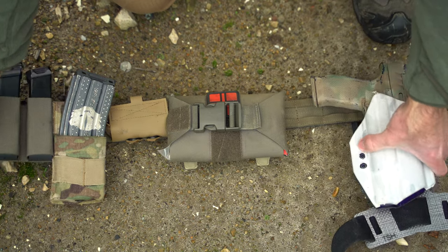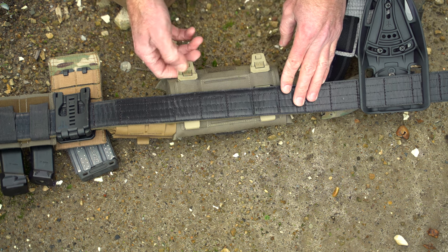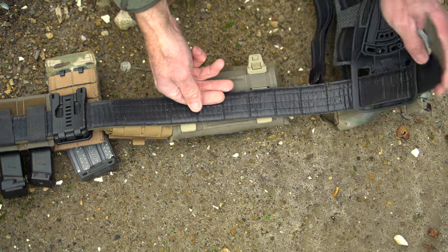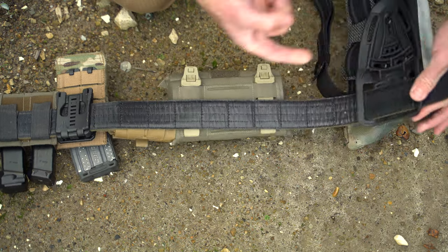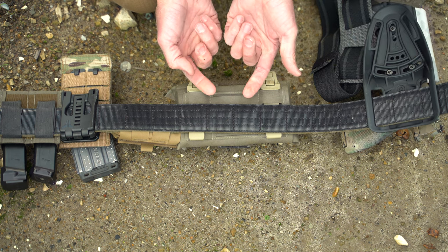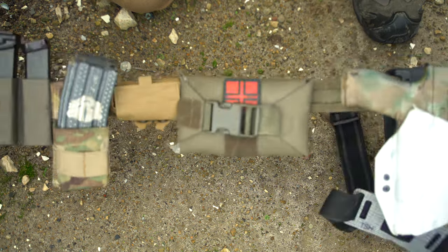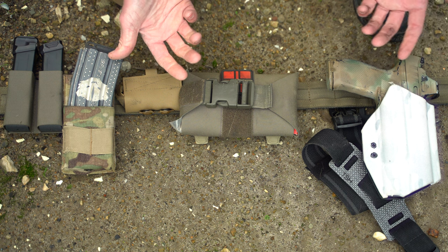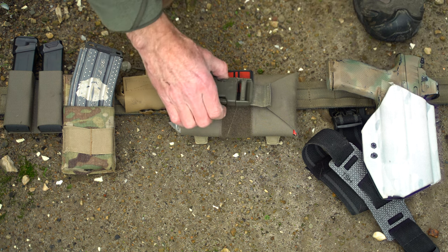Right here it's set up on this war belt. On the back we can see these clips by Maxpedition — undo those, slides through, and it essentially goes through any type of PALS webbing. The way these slits are cut you can actually run it vertically or horizontally, kind of however you want to do it.